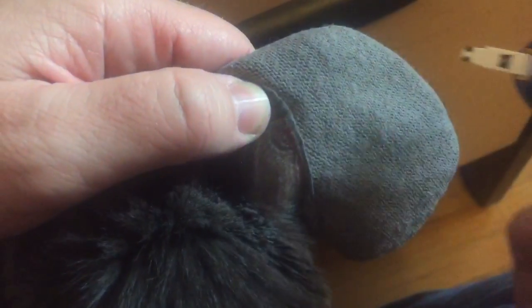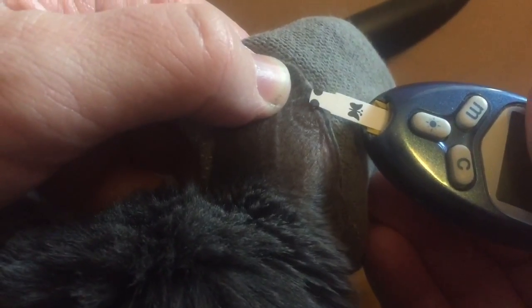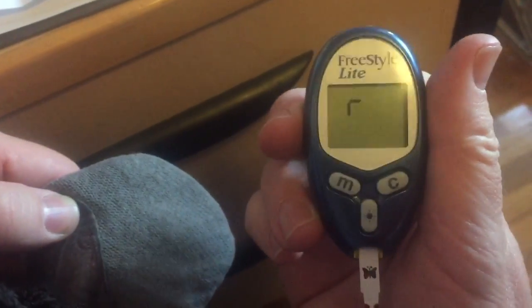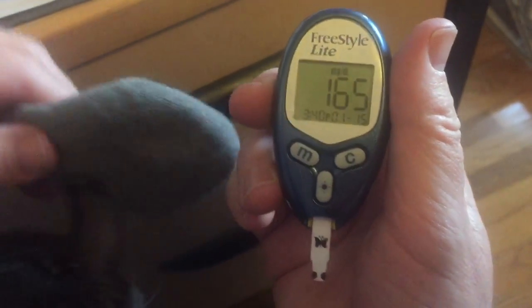Now you get a little bit of blood there. You can squeeze it out if you want — that's all you need, just a little drip. You take this and touch the blood to the little black part right there. There's a little beep, you wait a second, and the number comes up: 165.